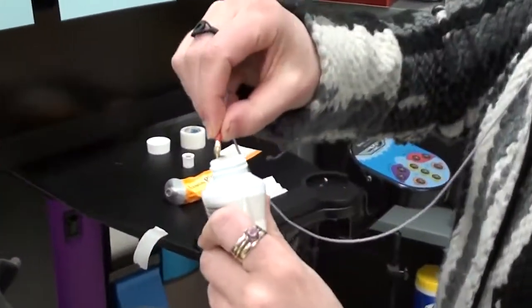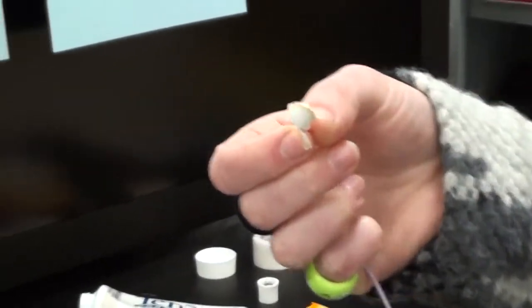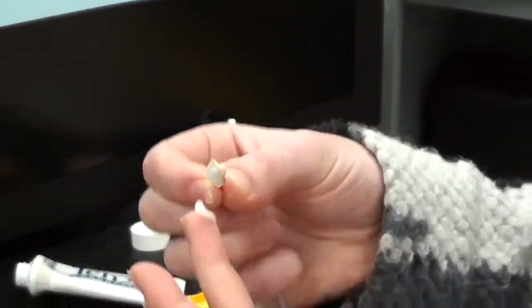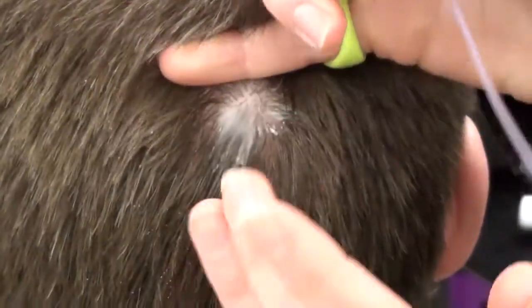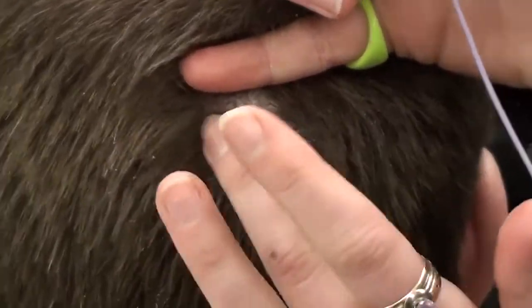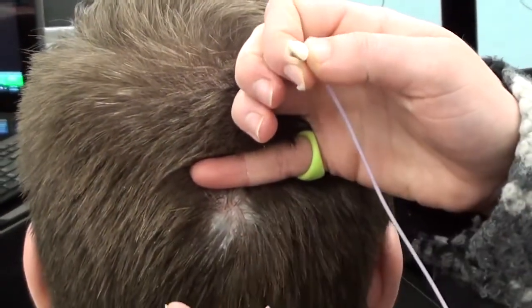Next, we take our conductive paste in a gold cup. To help ourselves, we would like to first make what I call a landing pad — taking some of this conductive paste and putting it down on the surface of the skin to help with making good contact. We do this to move some of the hair out of the way and also to make a preliminary conductive layer on the skin.